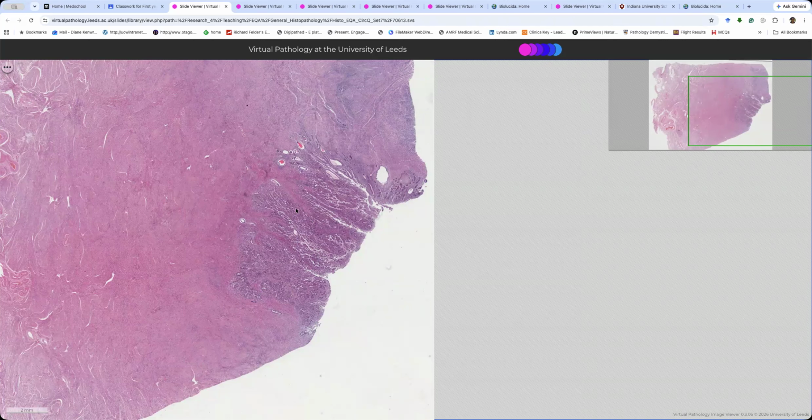So now we've got a serous carcinoma. Great. We've confirmed it by doing a P53, an ER, and a DNA mismatch repair. Okay, so we do all those on all three. And the P53 is strongly positive in all the nuclei. Yes, we go. It looks like a serous. It's P53 mutated. Diagnosis confirmed. Is it invasive? Let's have a look.